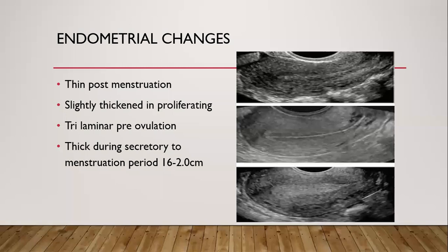Of course, this is more at secretory phase, so you should not have an endometrial cavity that is more than 2 centimeters.